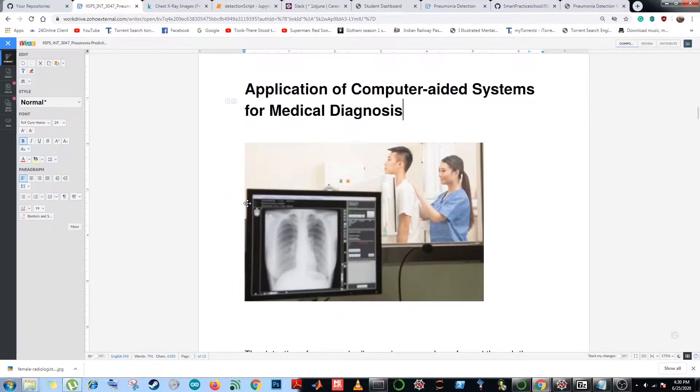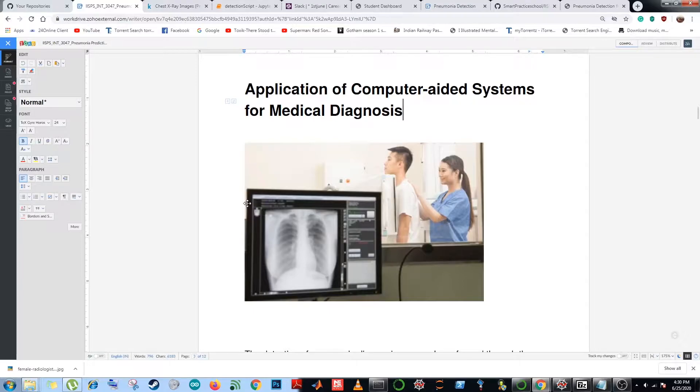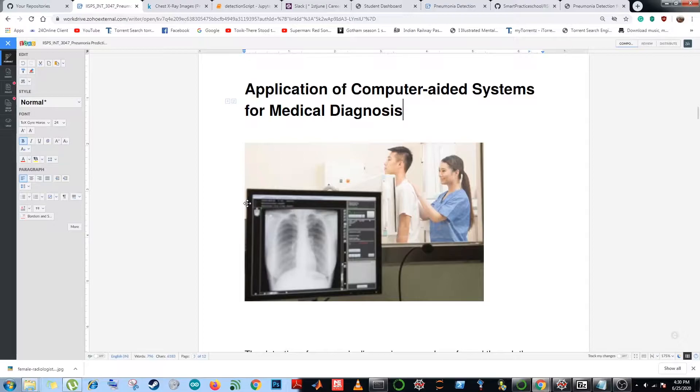The detection of pneumonia disease is commonly performed through the examination of chest x-ray radiographs named CXR. The pneumonia diagnosis on CXR is hectic due to the presence of scenarios and conditions in the lungs such as bleeding, fluid overload, loss in volume, post radiation, or post surgical changes.